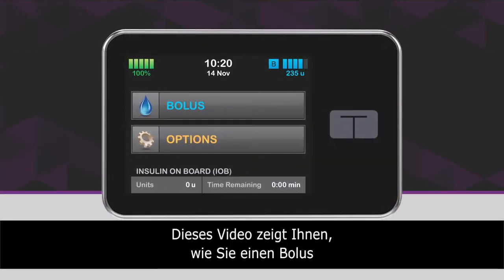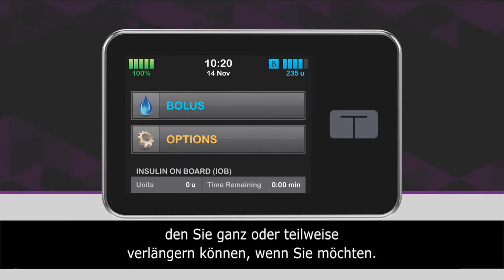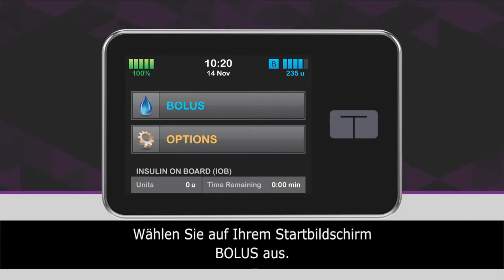This video will walk you through the steps for delivering a bolus with your T-Slim X2 insulin pump, as well as extending all or part of that bolus over time if you want. From the home screen, tap Bolus to access the bolus screen.